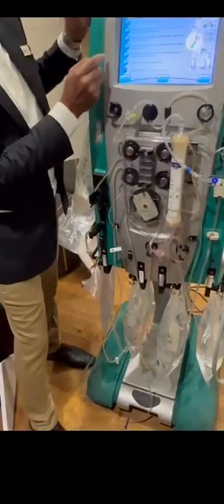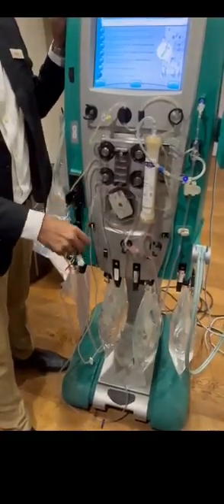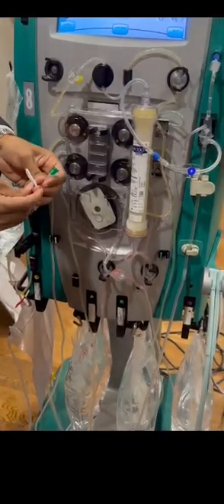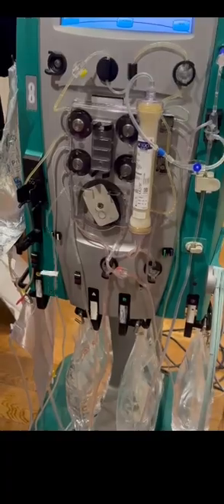Connected. Then what it's saying is, clamp the syringe line on the set. Okay, this is the syringe line. In the new set it has become open, so we have to close it because we are no longer using this line. We are not giving any heparin. We are directly giving the citrate and the calcium to the patient.